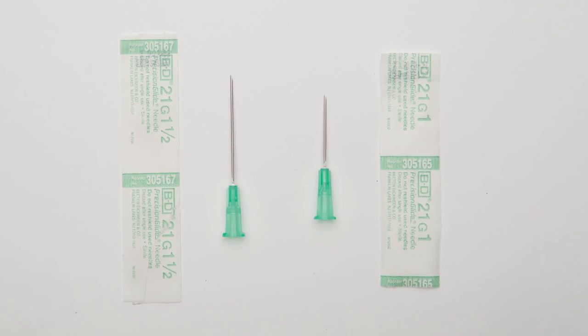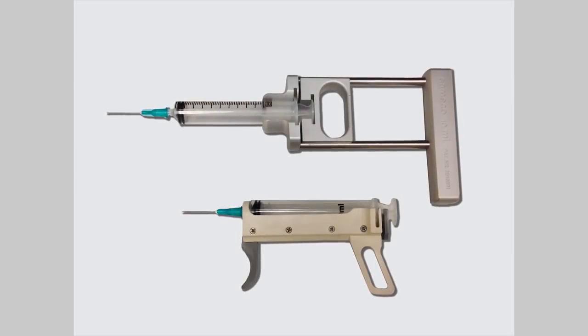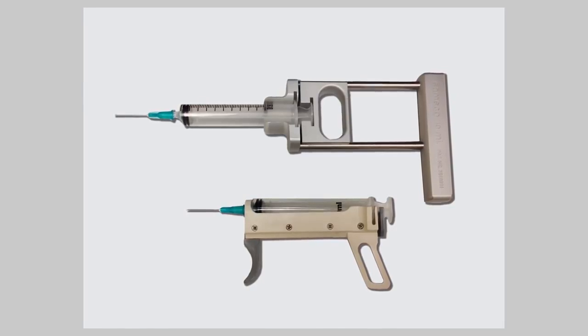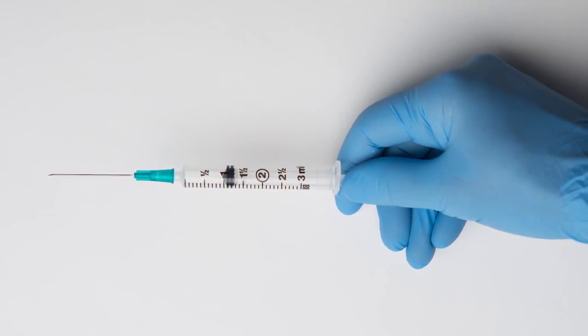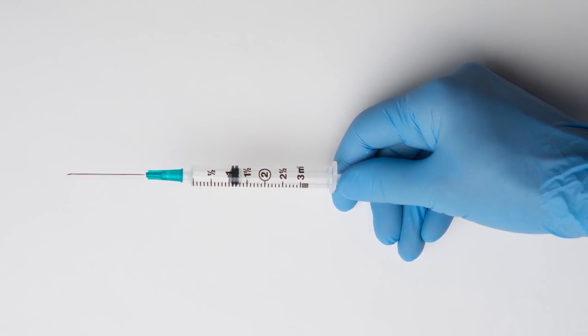fat fragments. Slip-tip syringes are recommended for easy removal of the needle after sampling and for expelling the material for sample preparation. 10 milliliter syringes fit most syringe holders designed for FNA sampling. Using a holder when sampling palpable lesions is highly recommended. If sampling with ultrasound guidance, a smaller handheld syringe can be used as an alternative.